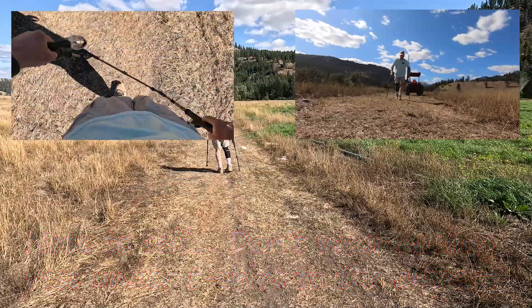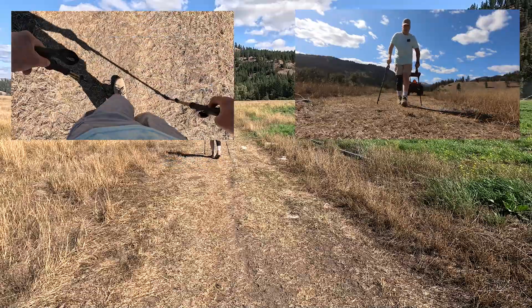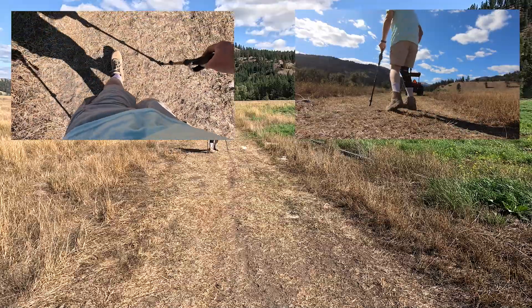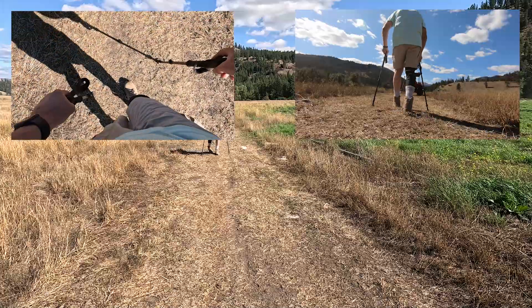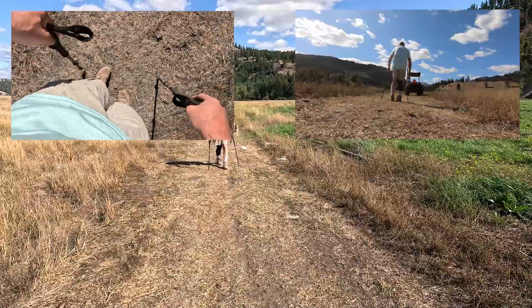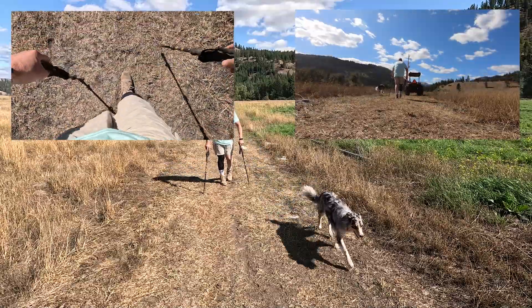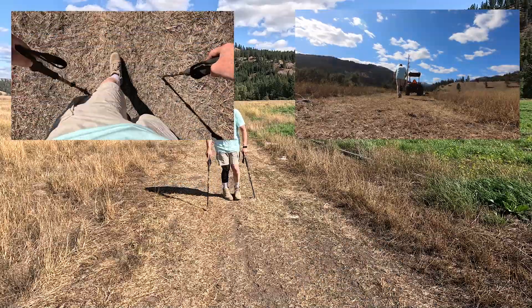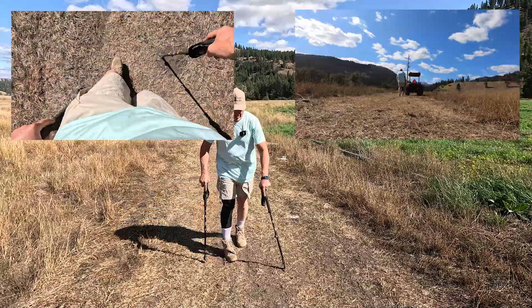Almost like I'm wanting to cross my leg as I walk. There's a good scuff. During the wintertime, actually walking in the snow, I leave trails. That is how I want to walk without any correction, guys — it's that bad. And there's almost a complete cross.